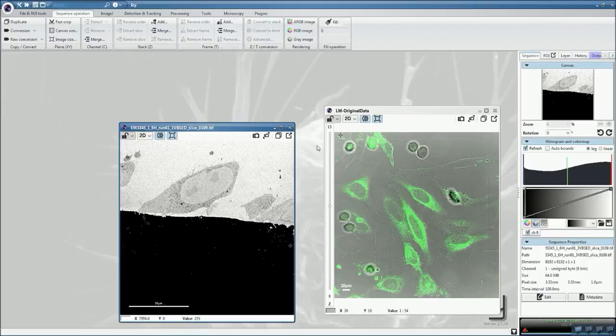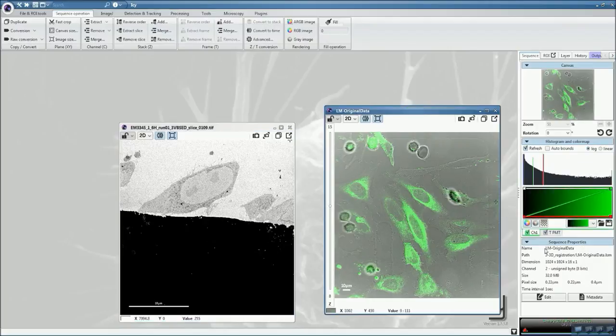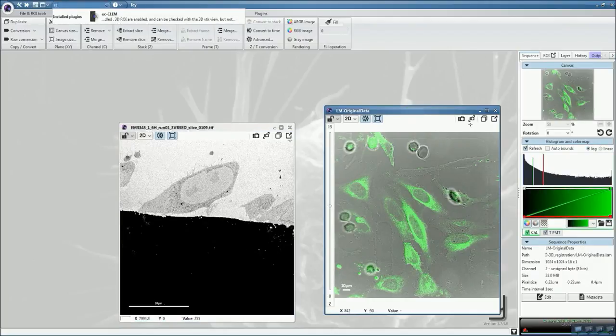Open your two images. Ensure that the corresponding pixel sizes are right, and then start ec-CLEM.